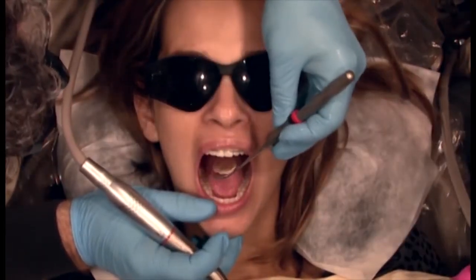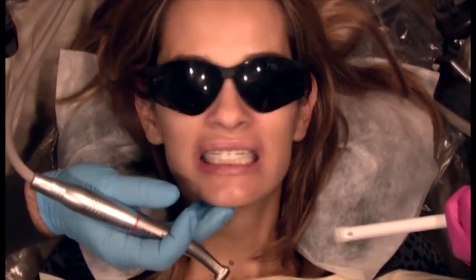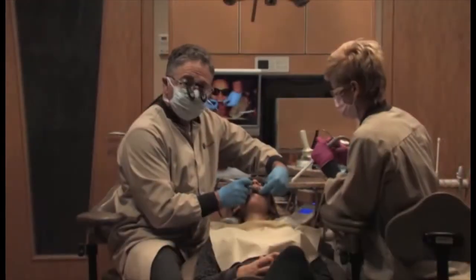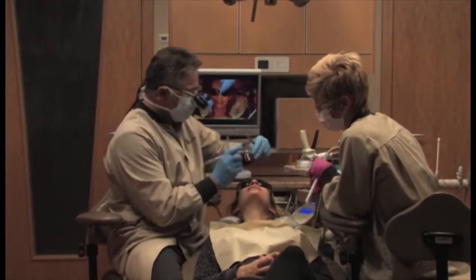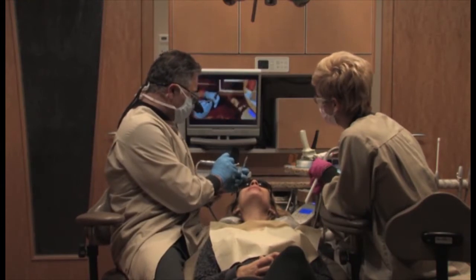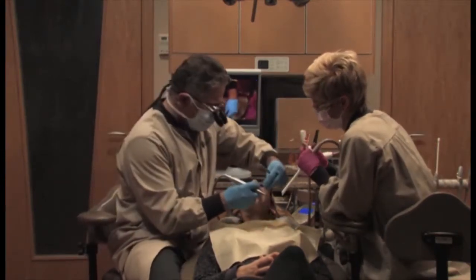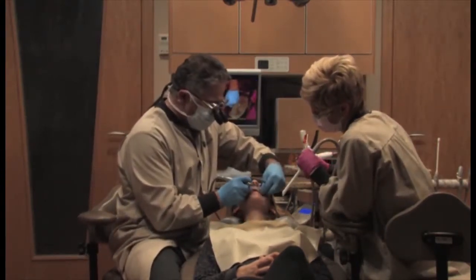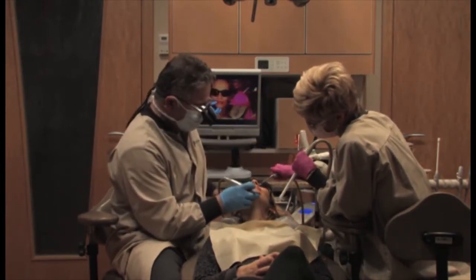Okay. Perfect. Close. Any teeth hitting in the back? Okay. Again, I'll take the deprogrammer out and reduce the spot. Again, remember, care and attention must be taken to keep the spot absolutely horizontal on that platform.